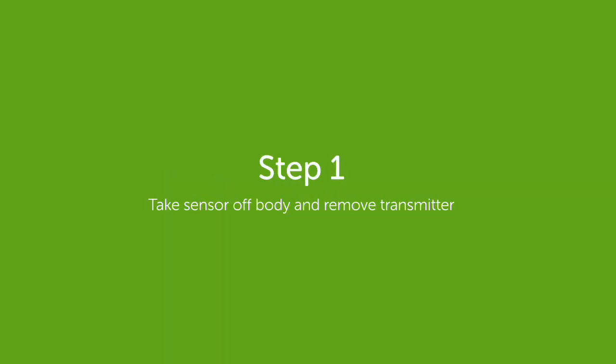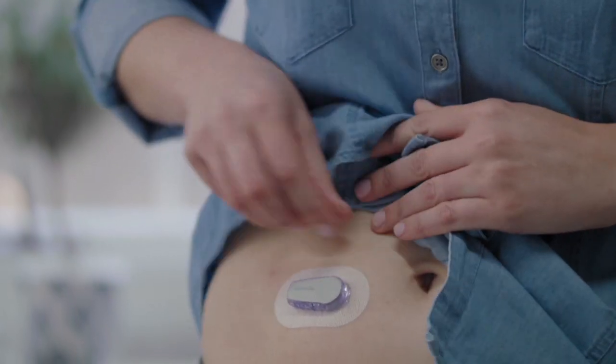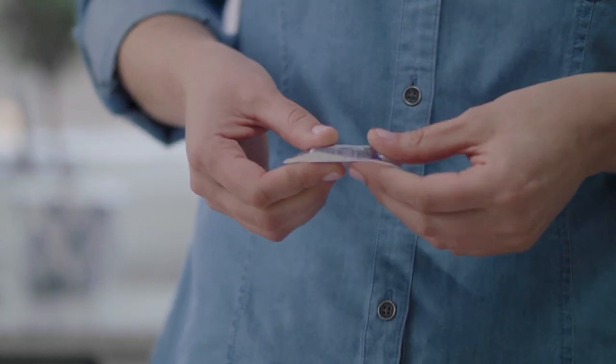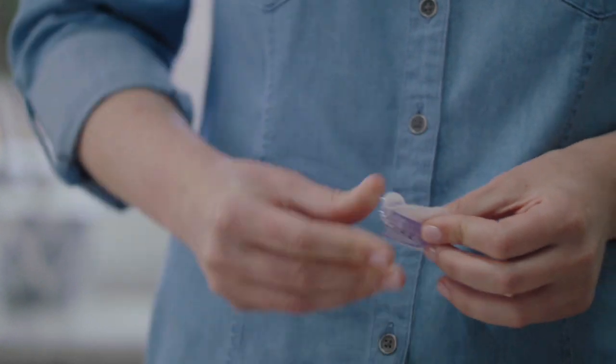The first thing you need to do is remove your sensor and transmitter. Grab the edge of the adhesive patch, peel the adhesive and the transmitter up and away from your body like a bandage. Now remove the transmitter from the holder. To remove the transmitter, push down the lip and break the wide end of the transmitter holder. Pull the transmitter out of the holder. Dispose of your transmitter.